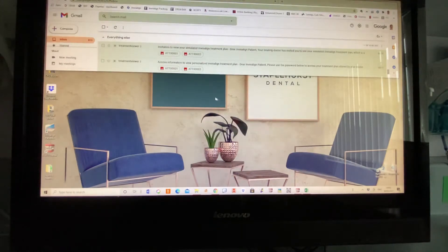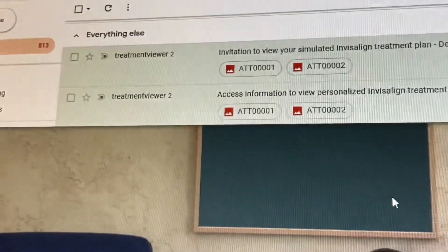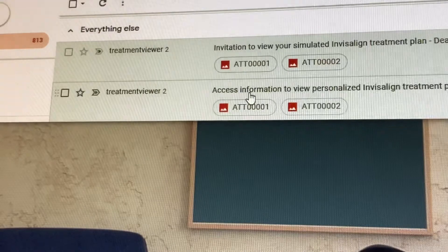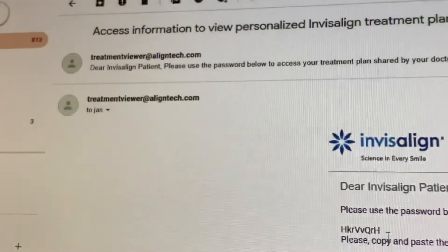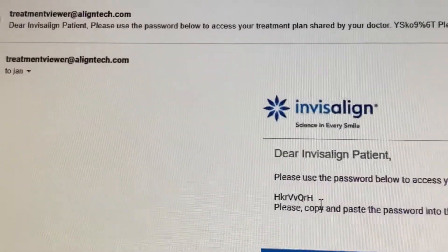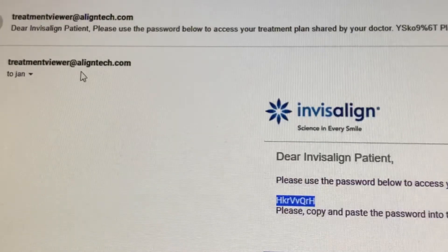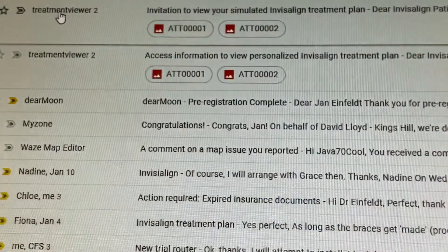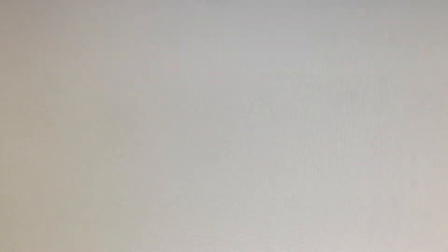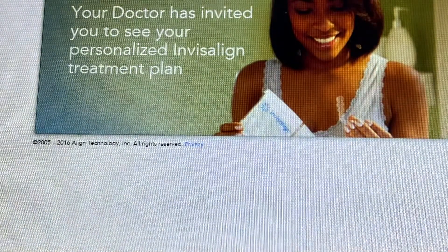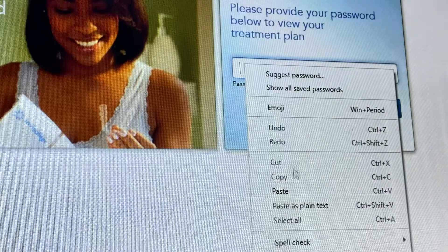What's going to happen is you will get two emails, and it would look something like this. It's a treatment viewer. The first email, if you click on it, will contain the password. What you have to do is highlight it — it says it in the email as well — copy it, then go back to the second email, click on that, click 'View Treatment,' and it will ask you for the password. You just click in the password box, right click, and paste.